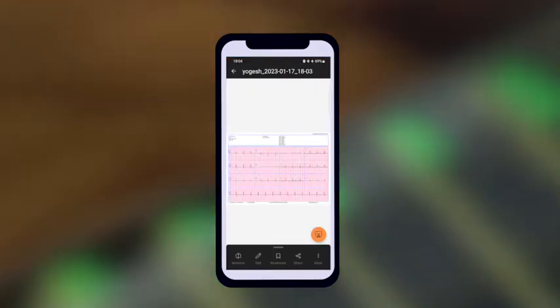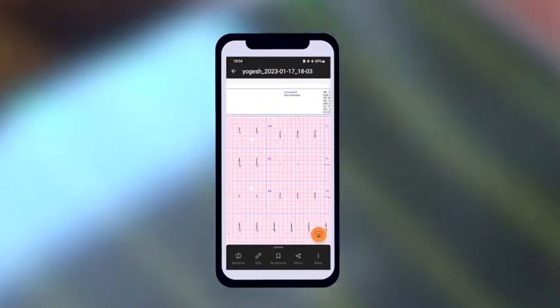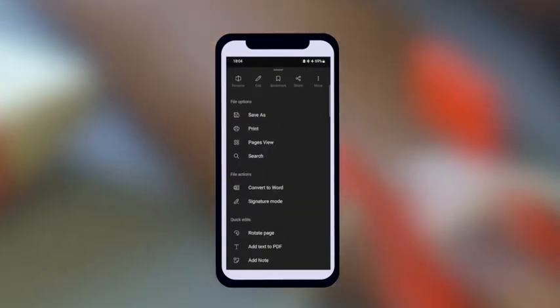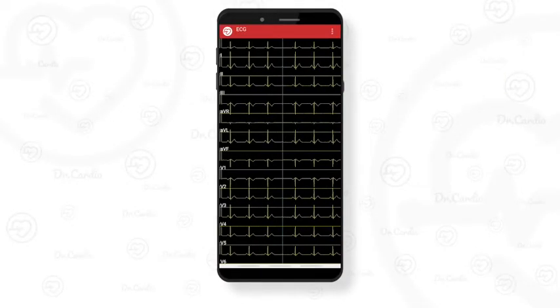You may choose to print out the ECG report right away via a Wi-Fi printer by clicking on the print icon. The user may also WhatsApp, email, or print the report directly from the app to share with the patient.